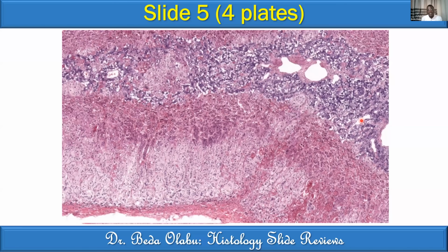All right, good. So give us your identification based on what you've narrated. I'm not sure, but I think it's an adrenal gland. Okay, he thinks adrenal gland. I'll give it to another person. I'll give it to Raymond. Thank you, Christian. Raymond? Hello, sir. Yes, Raymond, carry on.